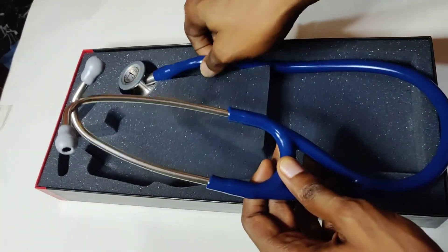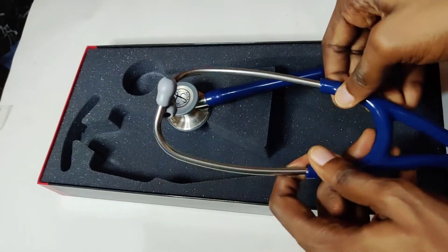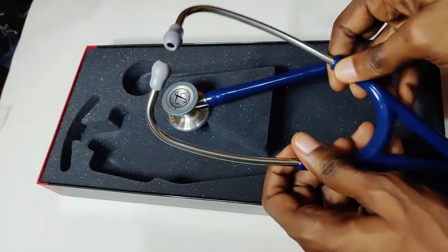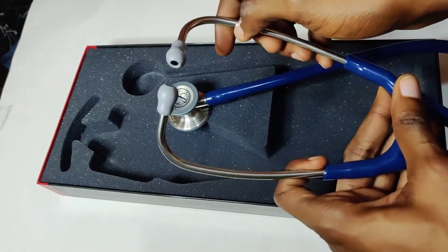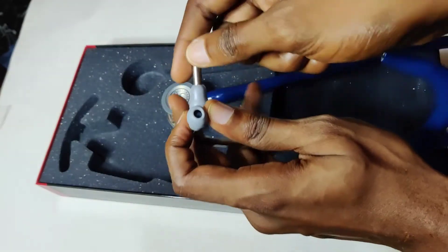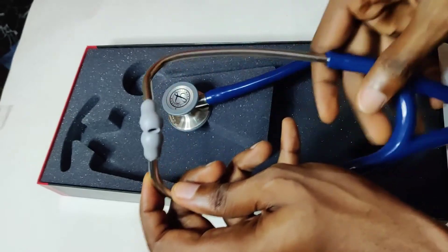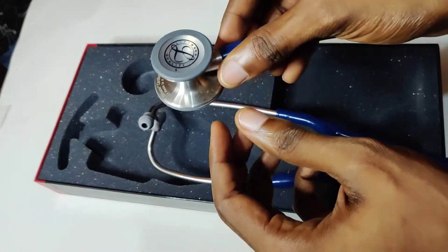Here we have the Littmann stethoscope. You have to pay attention to these areas — look at how curved the ear tubes are. This is to give you comfort whenever you put the device on your ear, which the fake doesn't have because it's not as curved as this. Then you have to pay attention to the earpiece — it is very, very soft.